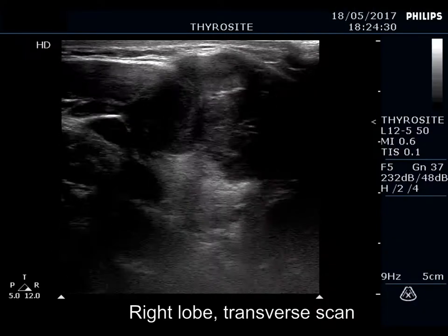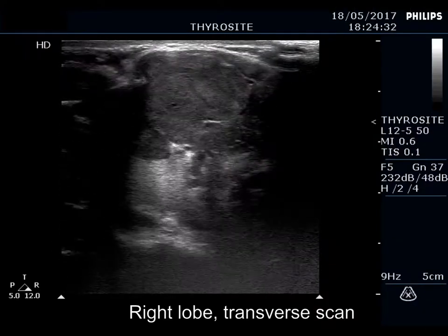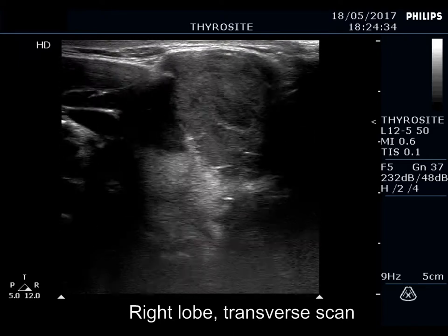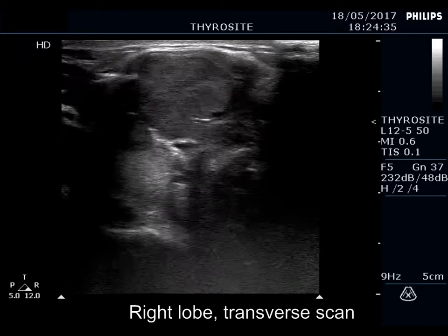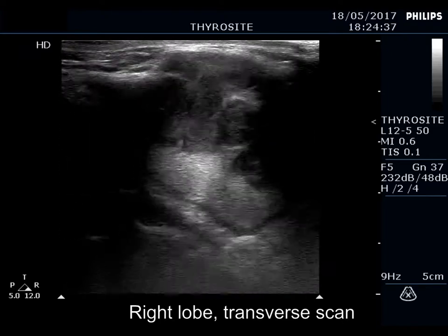The thyroid is ecnormal. There is a hypoechoic mass in the ventral part of the right lobe. The borders are irregular, lobulated.